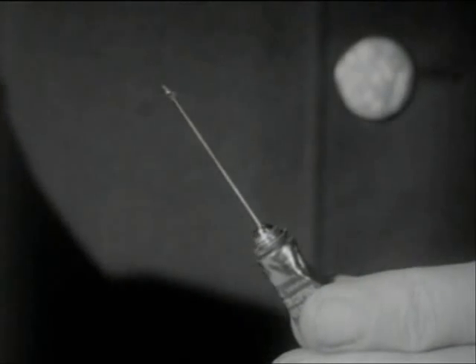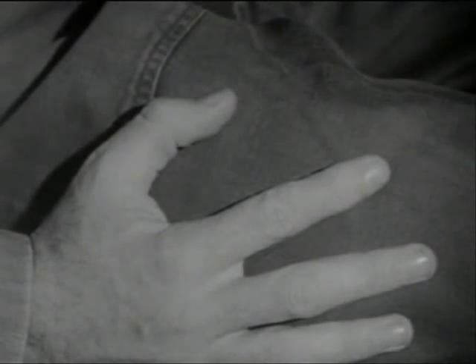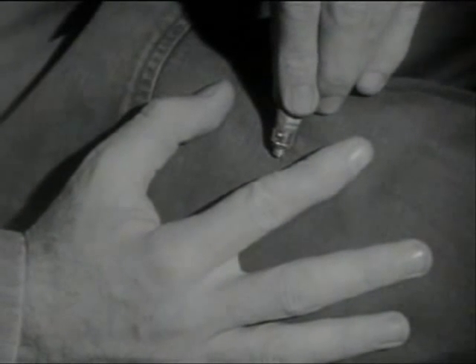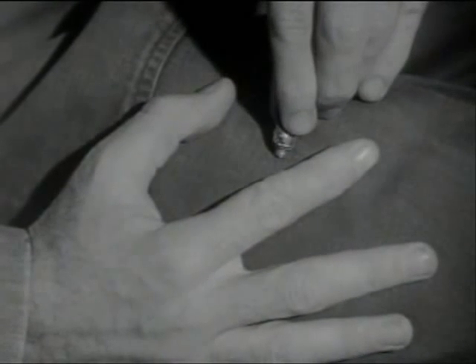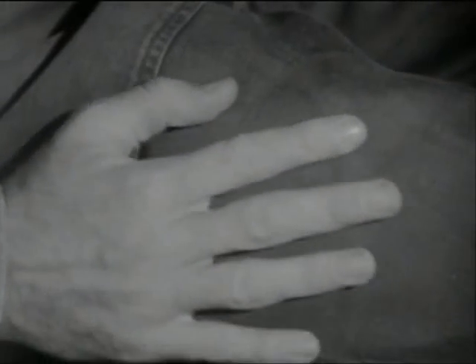The wire loop is removed and discarded. The needle is injected into the muscle. The injector is grasped at the point where the needle joins the tube; the tube itself must not be squeezed until the needle has been completely inserted. Then the tube is squeezed slowly until the entire contents have been injected.